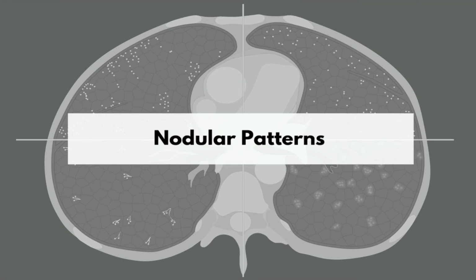Welcome to the fourth lecture in the series. In this video, you will learn about nodular patterns of disease.